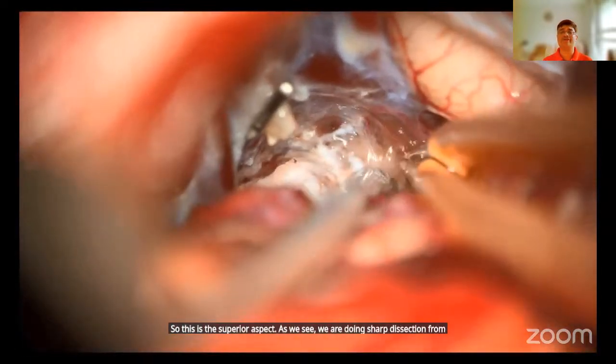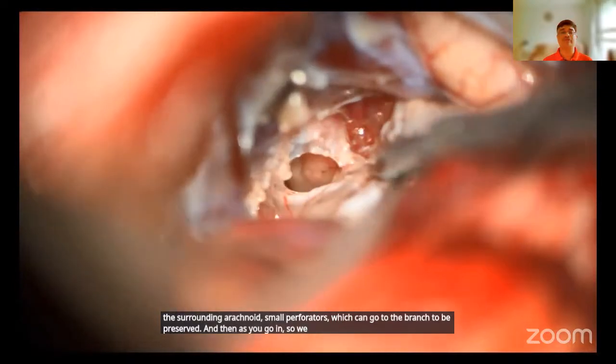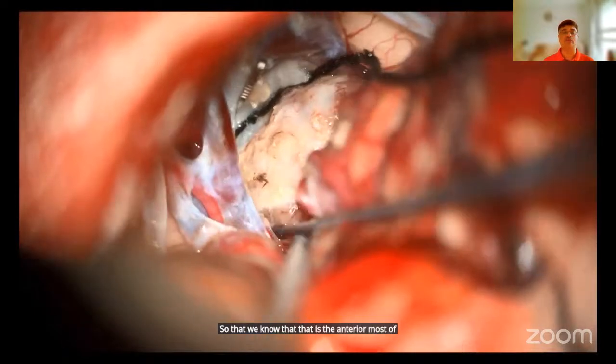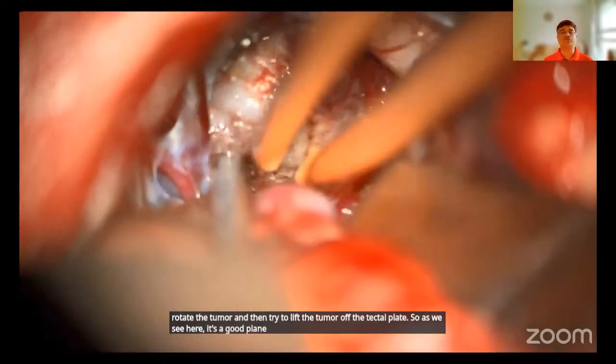As we see, we are doing sharp dissection from the surrounding arachnoid. Small perforators which go to the brainstem have to be preserved. And then as we go in, we enter the posterior part of the third ventricle, so that we know that is the anterior-most limit. Then we try to rotate the tumor and lift the tumor off the tectal plate. As we see here, it's a good plane, and we can see that slowly we are shrinking the tumor.